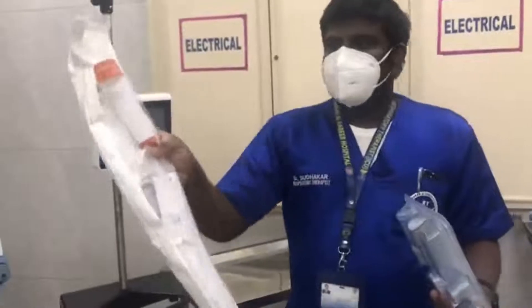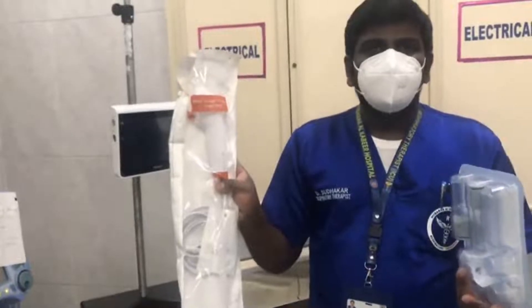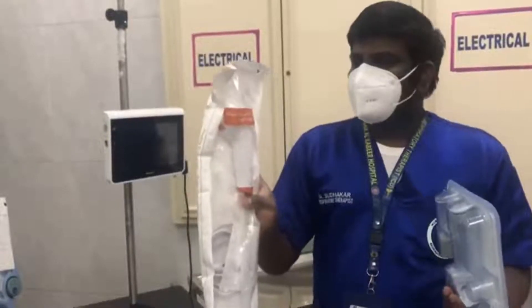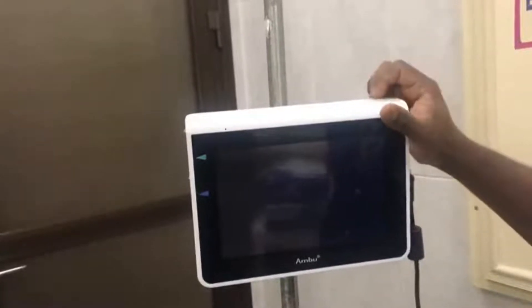This is the disposable AMBU bronchoscope - the plastic one. It is size 5.8. We have two sizes: 5.8 for adult and 2.8 for pediatric size. We are using only the adult patient here, so this is the 5.8. The common is the AMBU screen monitor. We can use it with the battery also - I didn't connect any power - just press here and the screen is on.